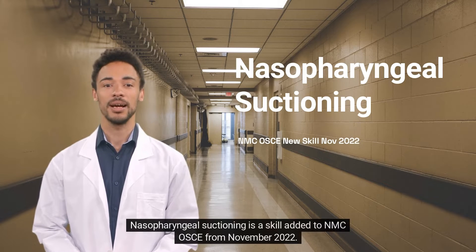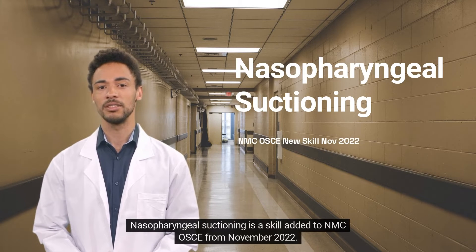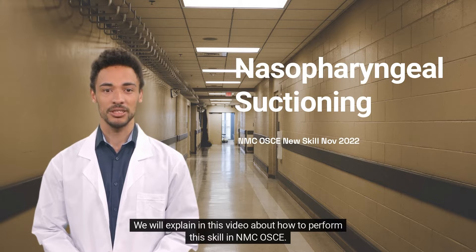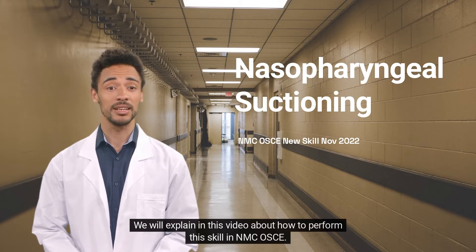Nasopharyngeal suctioning is a skill added to NMCOS from November 2022. The time limit for this station is 8 minutes. This video explains how to perform this skill in NMCOS.